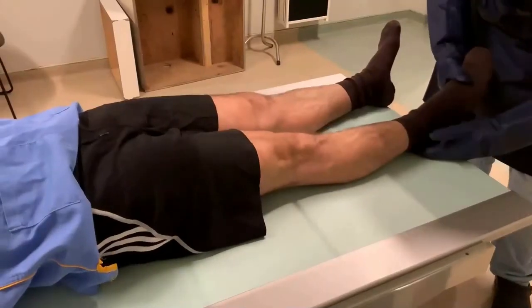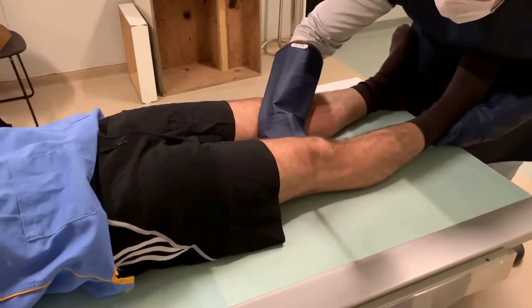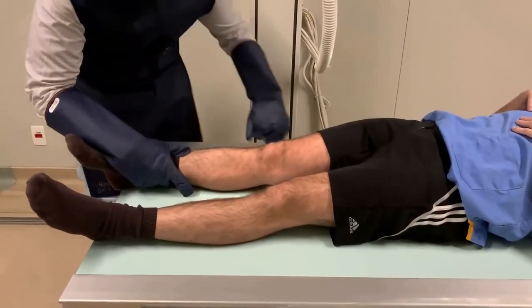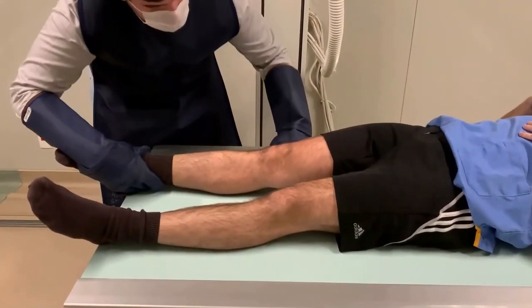We perform the same steps on the contralateral knee with the varus stress X-ray at 0 degrees, observing a 1.29 cm lateral opening. When the valgus stress X-ray is performed, a 1.18 cm opening is observed.